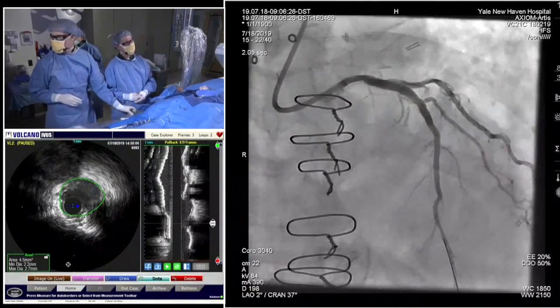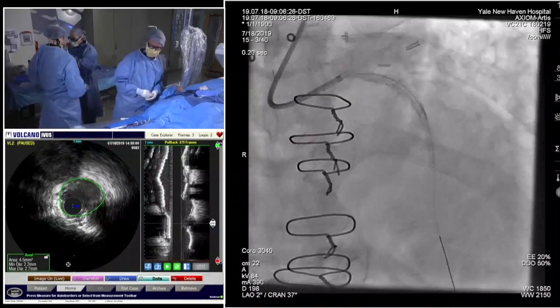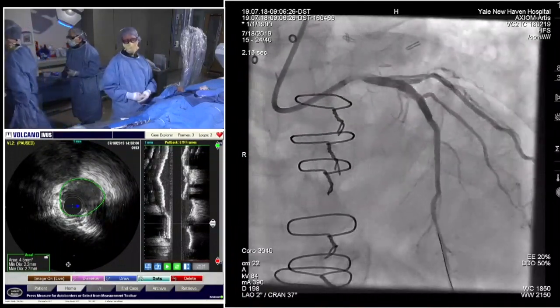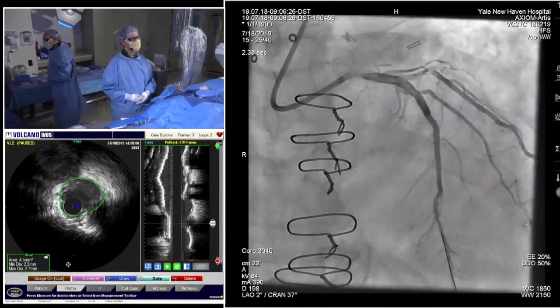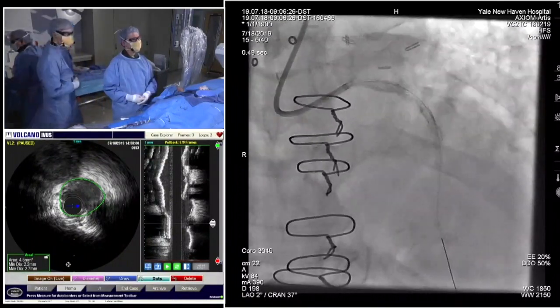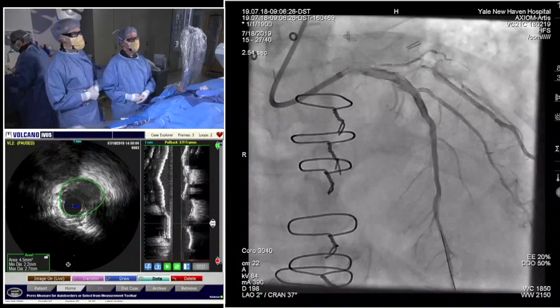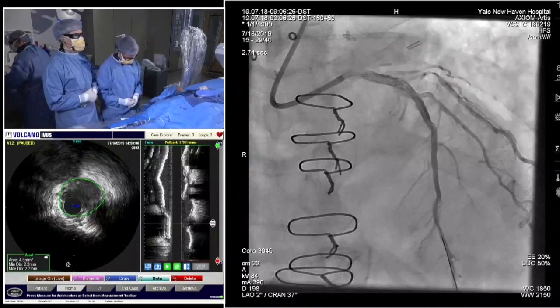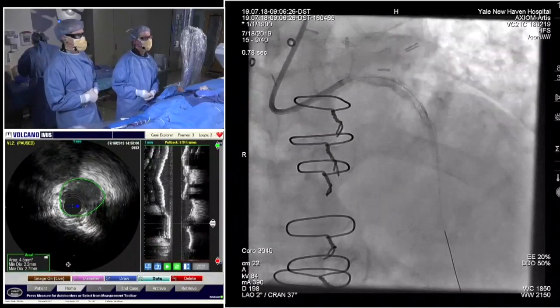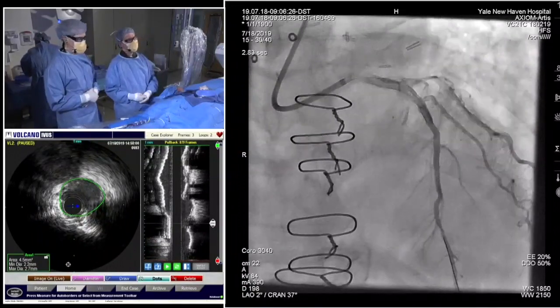Just so you know, we have 5 minutes remaining in the transmission. It's been actually great because you've done the case safely, got stents in, and expanded them well, because it's not just about delivering, it's also about expanding the stents. We'll keep watching you. Any other thoughts from the panel, Carlos, anything like that?